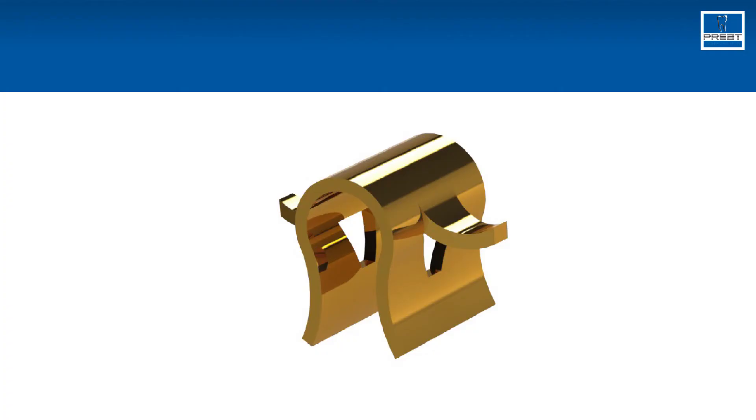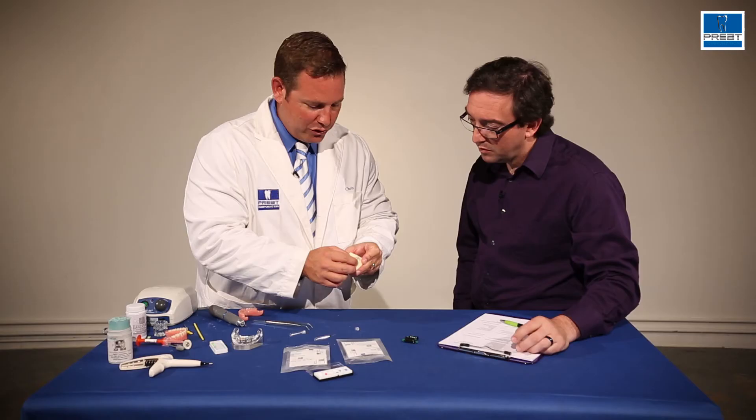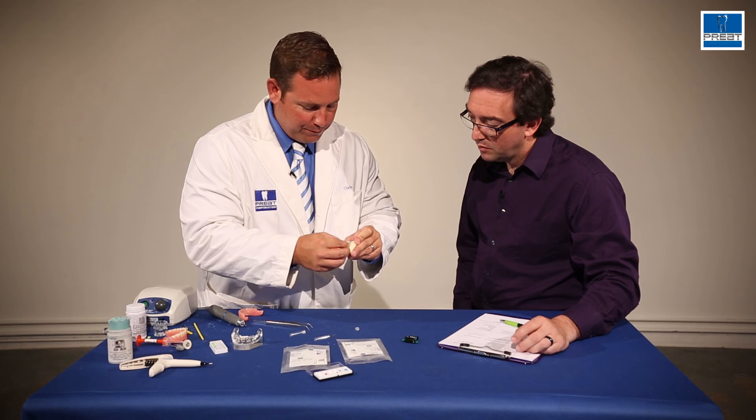On the other hand, the second style of the clip has buccal-lingual grooves on it that provide more mechanical retention in the buccal-lingual plane.